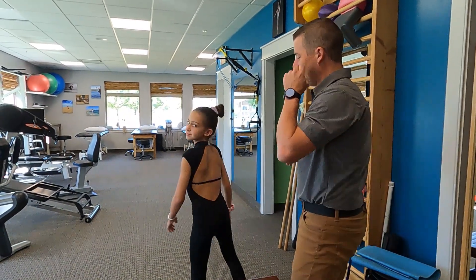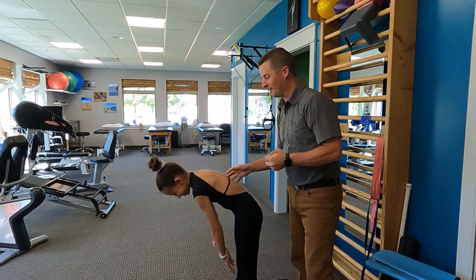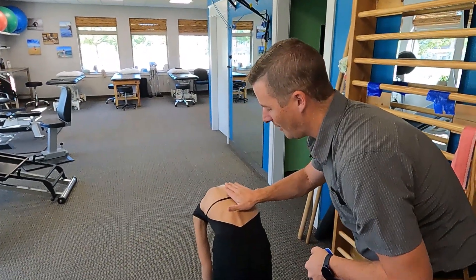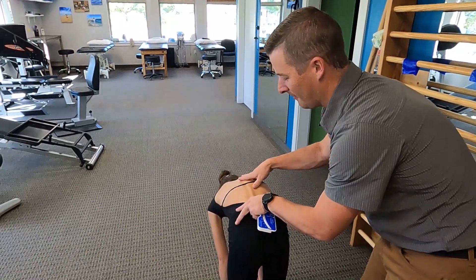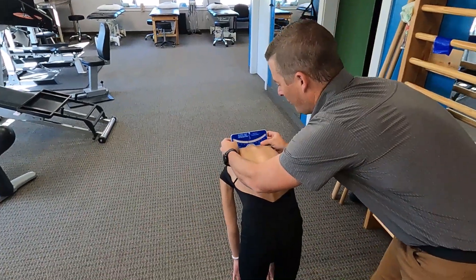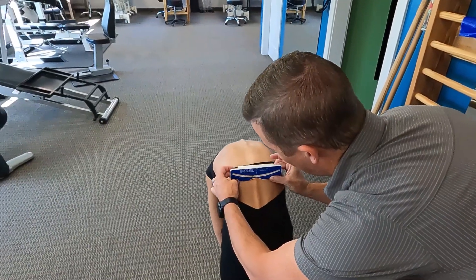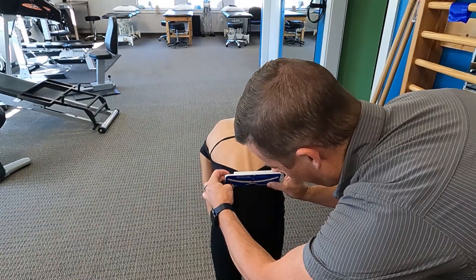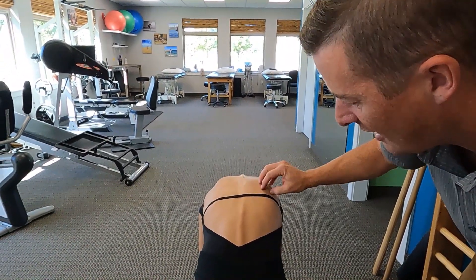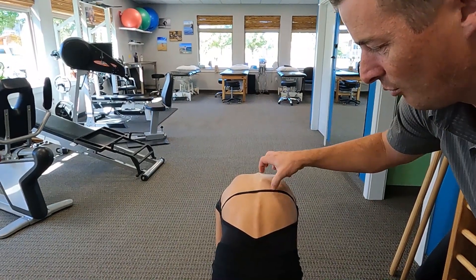So now, Sammy, go ahead and stand up. I want her to bend forward and touch her toes. Come back up a little bit and turn to your right. We want to round the back to maximize the rotation — kind of like an angry cat. Then we're going to follow the same thing, following the spinous process. Looks like we're about eight or nine degrees, and one or two degrees in the lumbar. We can see there's a raised right side in the thoracic, and the left side is lower than the right side. That's because her curve goes to the right, and that's why this is raised up.